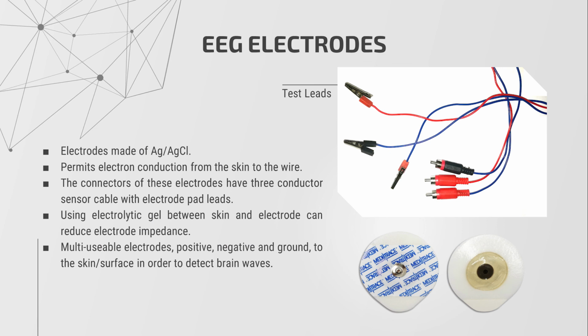There are 3 types of EEG electrodes available in the market: dry, semi-dry and wet electrodes. We have used the wet type, general purpose silver chloride based sticky electrodes, because the noise rate in wet electrodes is comparatively less than other types. Any ordinary silver chloride type sticky pads will work fine. These are easily available in almost every medical store.